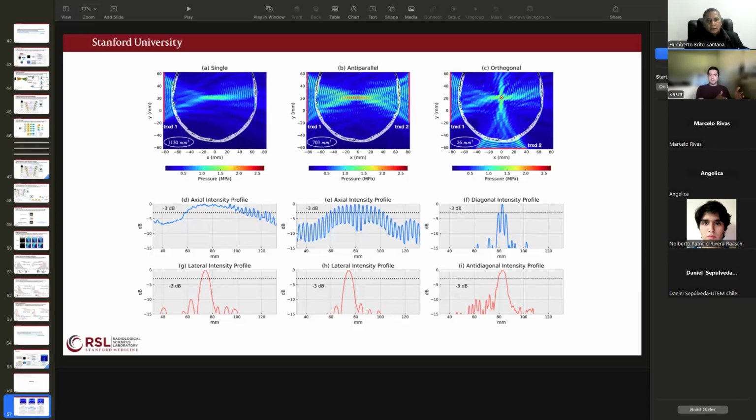There is another thing that transcranial focused ultrasound is being used for, and that is ablation, to actually burn the tissue. That one has already received approval from the FDA. I think every Friday at Stanford, we have patients who come in for essential tremor, and we treat them by raising the temperature so much at the focus that we are burning it. Essential tremor is a tremor in the hand, which is so bad that if we give these patients a cup of water to drink, by the time they bring the cup to their mouths, half the cup is empty. Water has splashed everywhere because of the tremor in their hand.